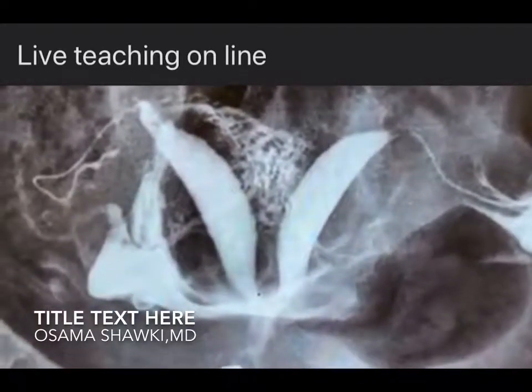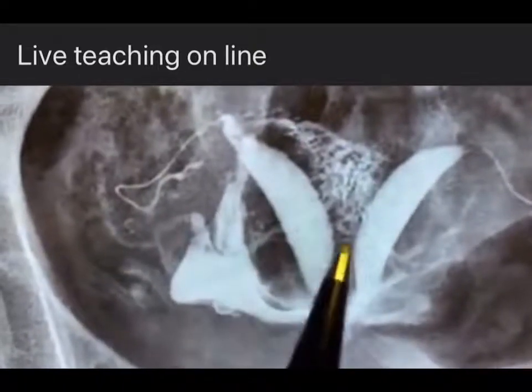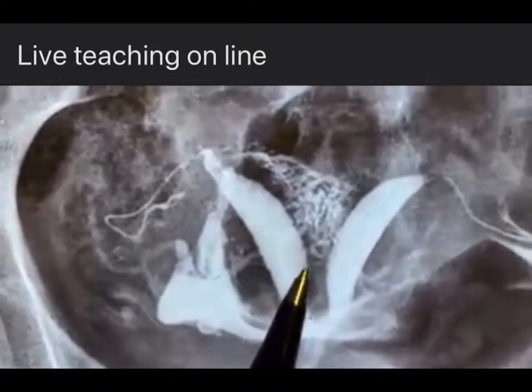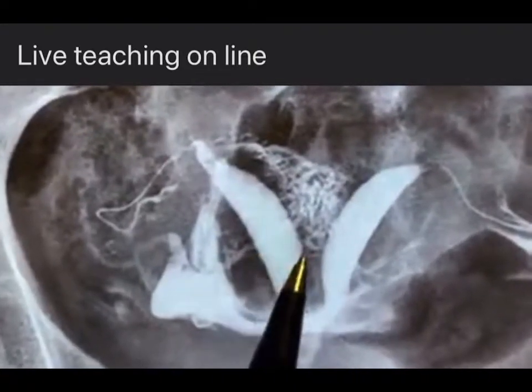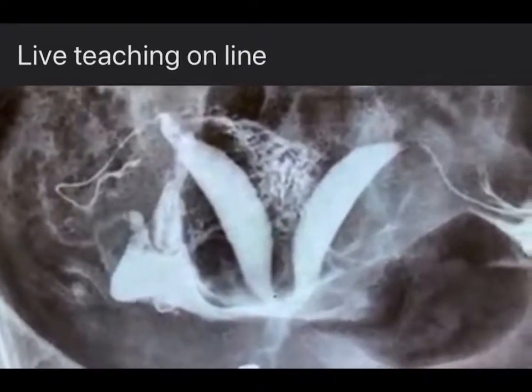Hysterosalpingography is confusing to many people to distinguish between a bicornuate uterus or a uterine septum. Just check this angle between both cornua. This is the angle. If this angle is less than 90 degrees, that's 100% septum.